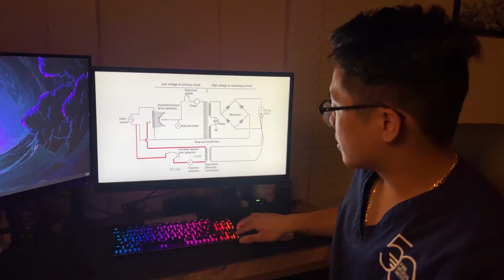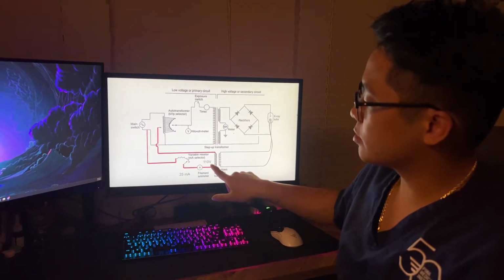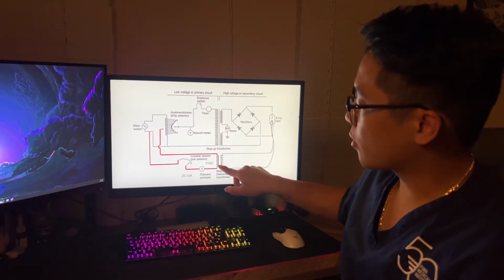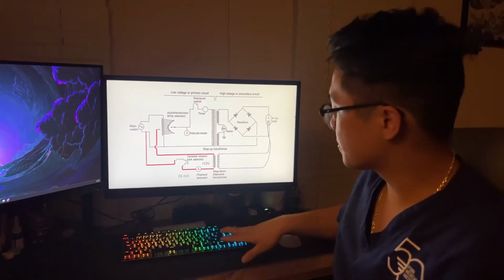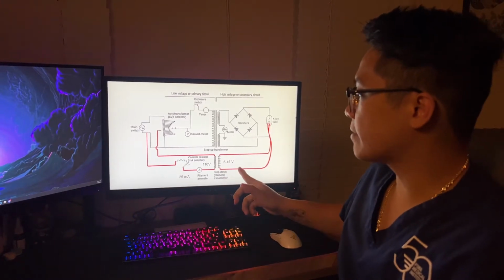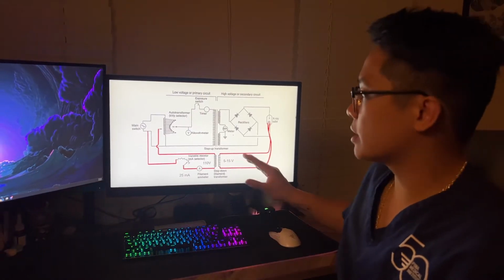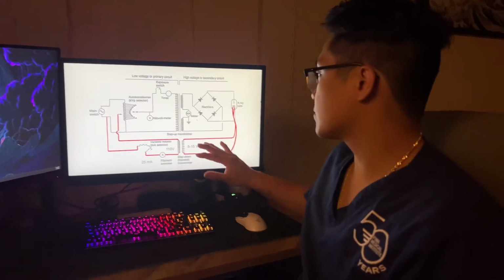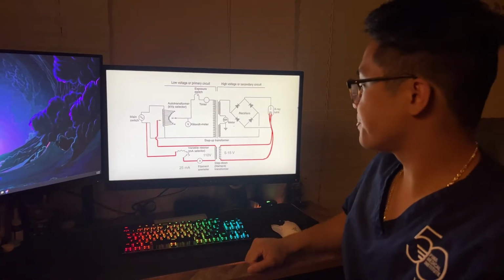So continuing on, we talked about the 110 volts that is supplied to the whole circuit, continuing down right here. We can see in this primary coil that there are more coils than on the secondary coil, so this would be a step down transformer. Stepping down that voltage, we go from 110 volts to 5 to 15 volts, because anything higher than 5 to 15 volts could short out the filament or burn it out. So 5 to 15 volts will be perfect for the X-ray tube. This will continue that connection all the way up into the X-ray tube.